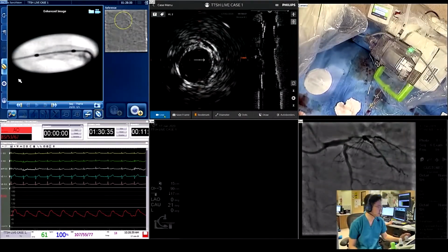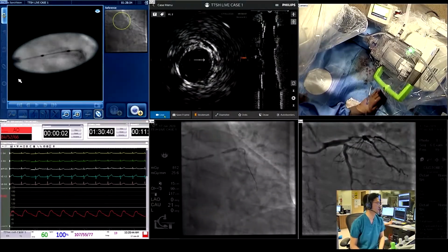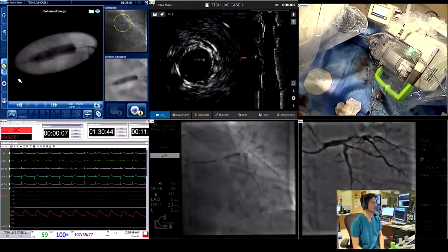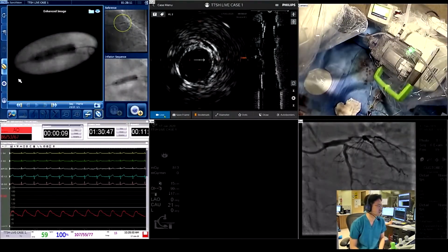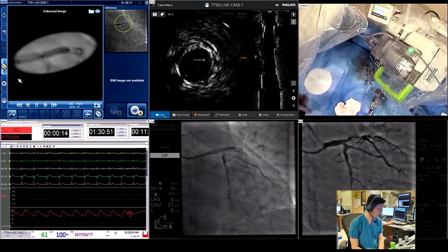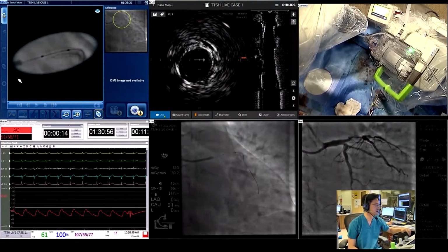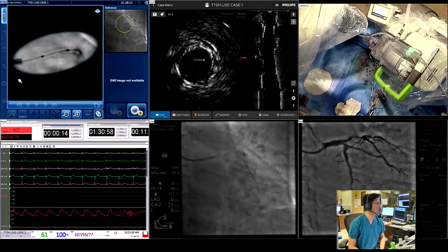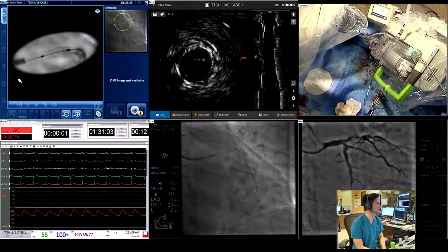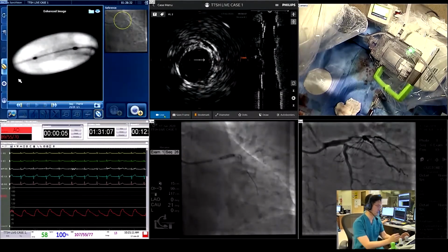Okay, can we go up here? Yeah. So Justin Davis just joined us in the panelist pool, so feel free to discuss anything you want. Okay, and just do a little test of contrast. Justin, you have this machine in your lab? We don't have the Corindus system, but we have most of the other equipment, the co-registration systems and imaging systems.